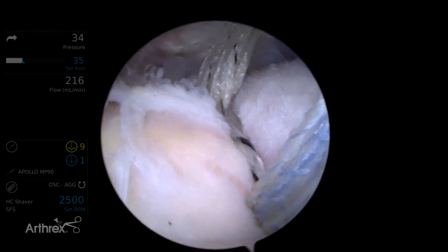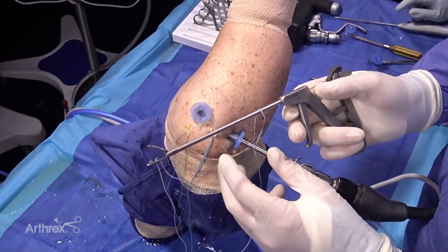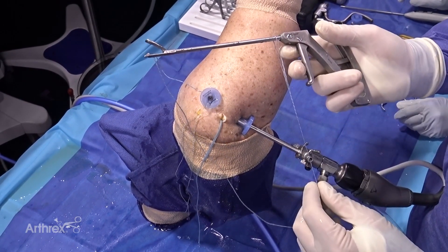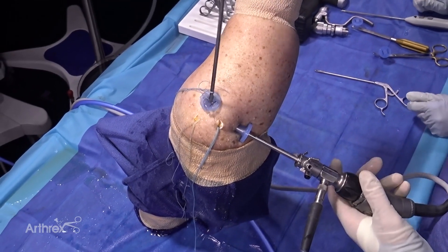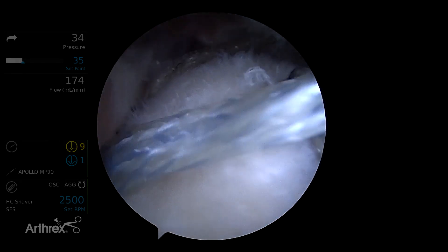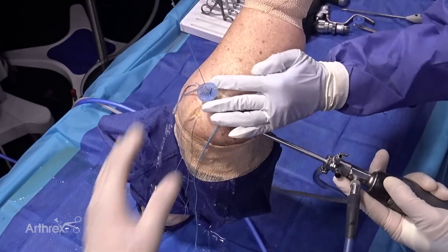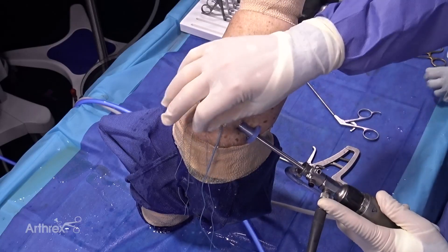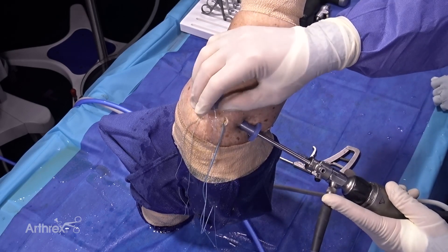Now all we have left are the tapes, and we're going to crisscross those like a standard speed bridge over to two lateral anchors. Now we're going to use the suture tape fiber link to show you how to reduce a dog ear. We already have this out from passing sutures through our two points through the rotator cuff. We'll use that same link here now for the posterior dog ear — pre-place it, come back just somewhat posterior to our sutures, make just a single cinch loop, and tighten that down. There's the cinch loop that's going to reduce the posterior dog ear, and we're going to include this in the suture group that goes to our posterior lateral anchor.